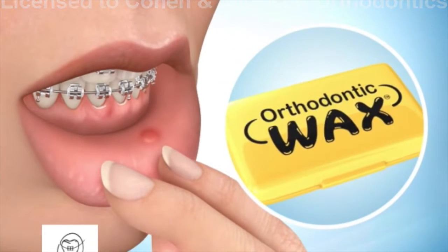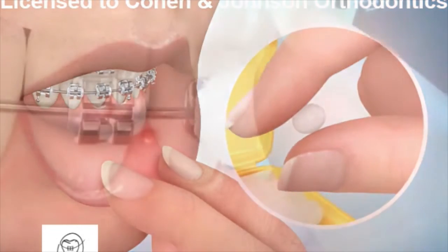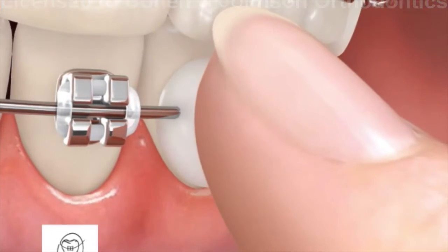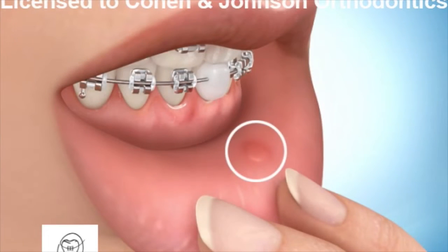Break a small piece off and roll it into a ball. Then place the wax directly over the bracket that is causing the pain. This will ease the pain and allow the sore to heal.